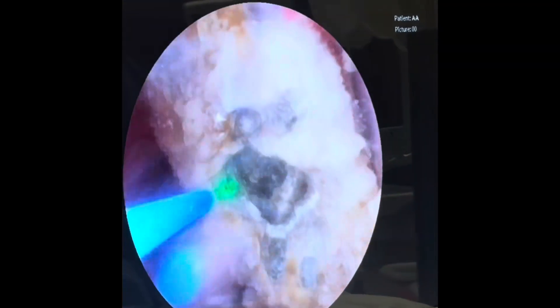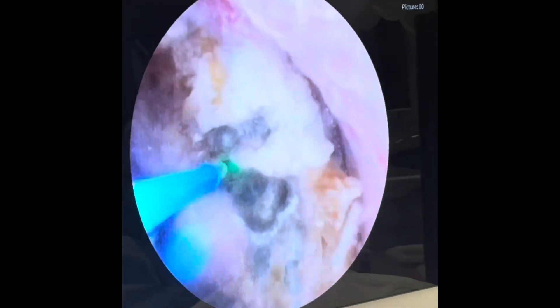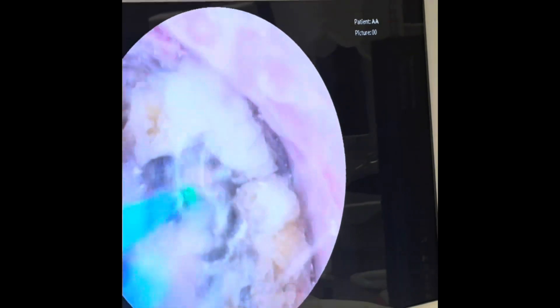Don't fire the laser on the pink, which is the mucosa, because it'll bleed. So we have to focus the green light of the laser on the stones.